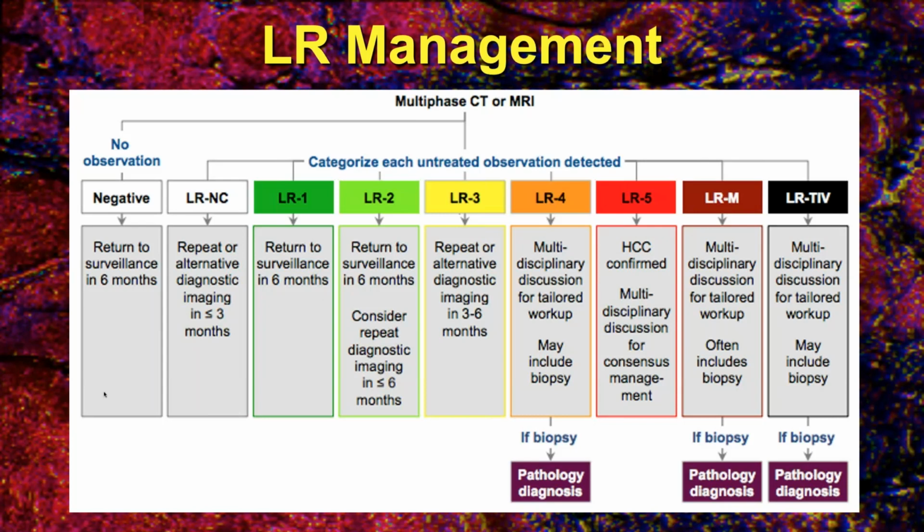Similarly, for LI-RADS 1, it's essentially a benign normal study. Go back to surveillance. Now, if the diagnostic imaging was not sufficient to be able to categorize an observation, well, by definition, the diagnostic imaging was indicated in the first place. So we shouldn't just go back to surveillance because the diagnostic test was unsuccessful. Maybe we can repeat it and do a better job, or maybe we now realize that a different study would be better. Maybe the patient is moving too much for MRI, and maybe CT would be better. And if indeed they need the diagnostic test, but this particular diagnostic test wasn't successful, we probably don't want to wait the full 6 months. We probably want to repeat it sooner rather than later. So these things really make sense. When you think through any of these, there should be nothing that doesn't make sense here.